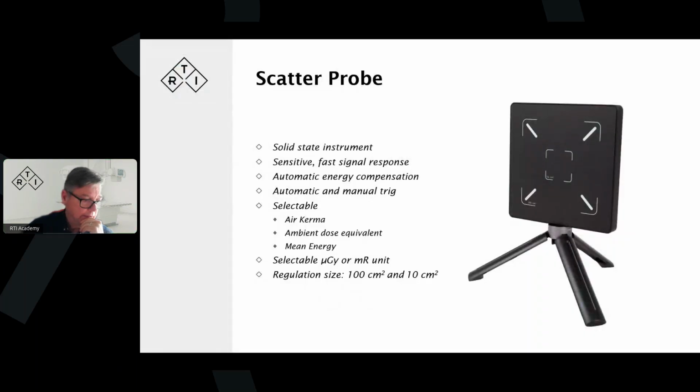And then we also have the possibility of a waveform graphic, which comes in quite handy, because we have the possibility of detecting whether it is just noise, where the radiation appears, and how it looks.